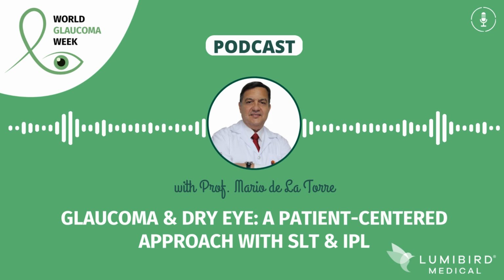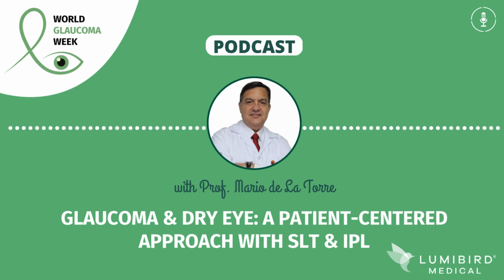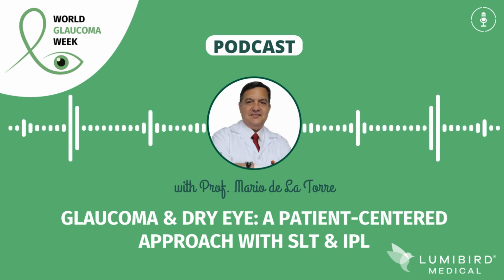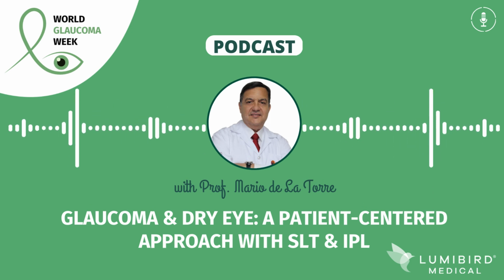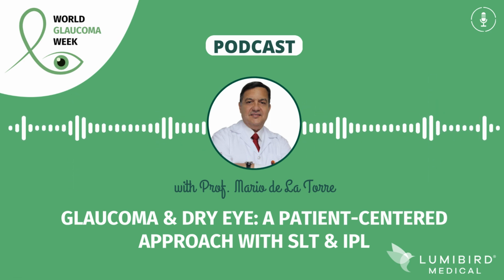This is important because the procedure is outpatient. It is well tolerated, and the most important thing, it provides a sustained reduction of IOP. It reduces the patient's dependence on topical drops, also improving dry eye symptoms when drops are needed. It could be sufficient for a period of time. Normally you can have 1 year, 2 years, 3 years, it all depends. And the advantage is you can repeat the treatment. That's great, because there is no damage to the trabecular meshwork. So for the patient, you can retreat if you also want to manage the IOP.